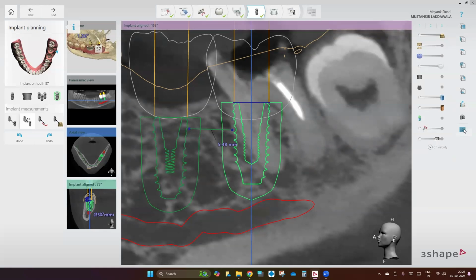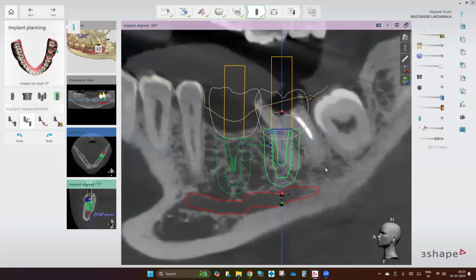So यहीं पे कहीं पे क्या प्रॉब्लम था? और you can go to the screenshot and just add it in the screenshot कि ये आपका ड्रिल प्रोटोकॉल है. तो instead of showing diagrams, you can put it like in simple words कि सर, first आएगा pilot drill 6 mm, then pilot drill 10 mm, then 3.6 10 mm, then 4 10 mm, then 4.5 10 mm, and then implant through the guide. खत्म बात. एक ही वीडियो जिसमें सब कुछ आ जाए.